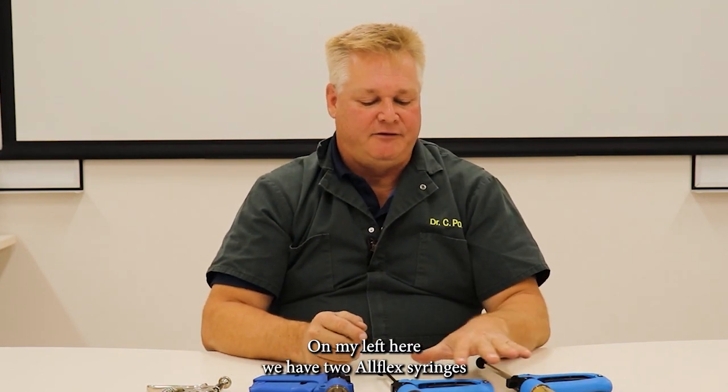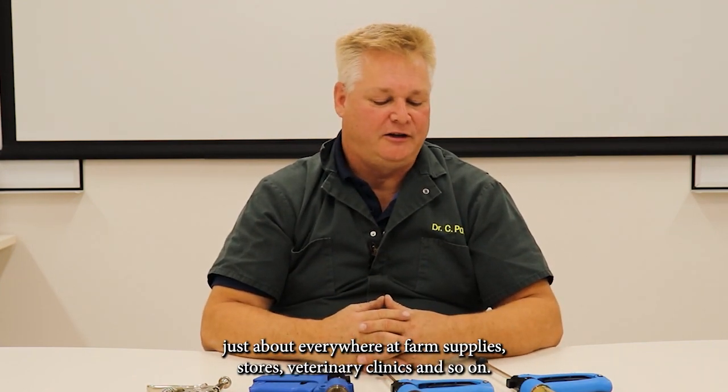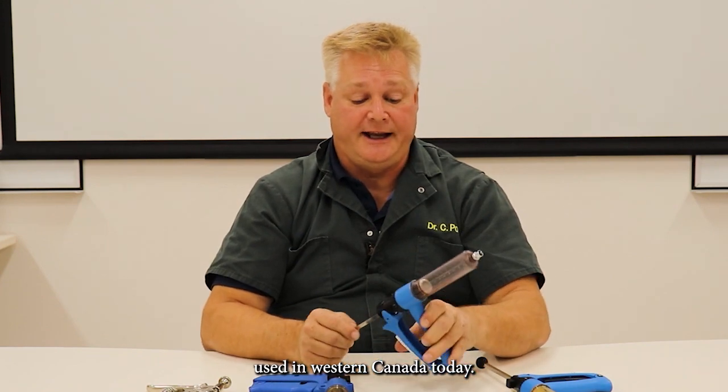On my left here we have two Allflex syringes. Allflex syringes are available just about everywhere — at farm supply stores, veterinary clinics, and so on. There are also a number of parts. This is probably the most popular syringe you'll see used in Western Canada today.